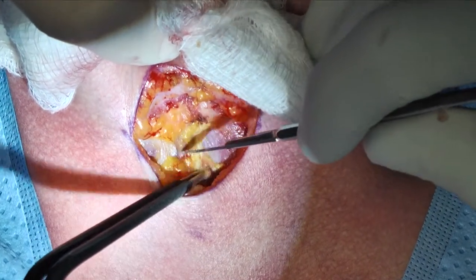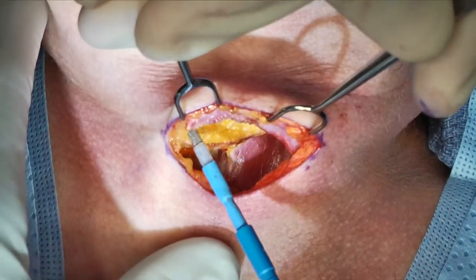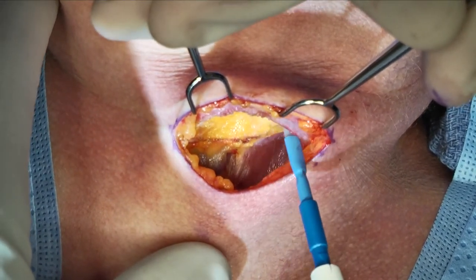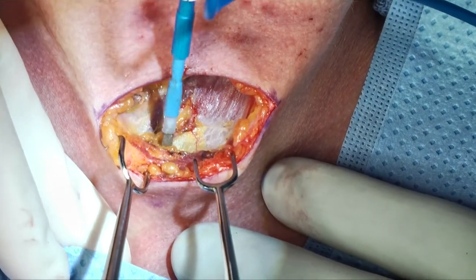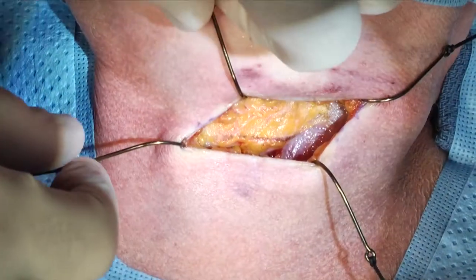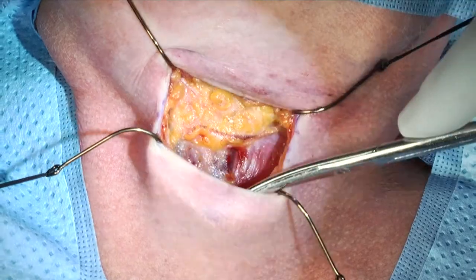We're starting to see the SCM on the left side of the incision. The head is superior, so this is raising our superior subplatysmal flap and then our inferior subplatysmal flap. You can leave some of the fat on the platysma as well. Basically, you're just trying to clearly see the sternocleidomastoid muscle and the strap muscles.